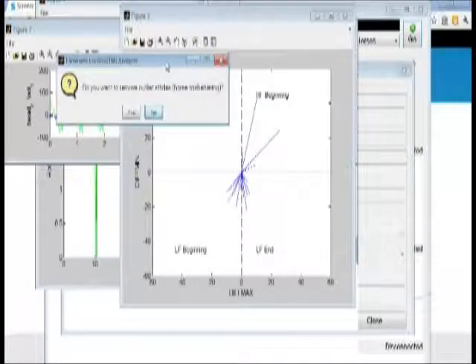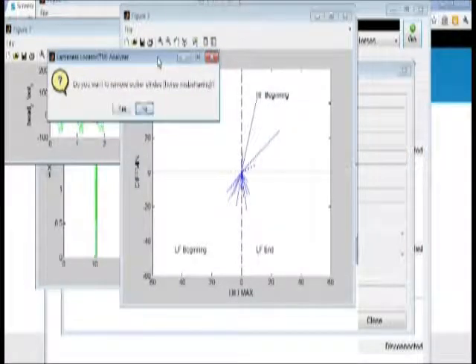In this particular case of a mild left forelimb lameness, since most of the rays are pointing downwards, notice that a few rays are pointing up into the first quadrant. These are most likely outliers and caused by the horse tossing its head during evaluation. Since they are large and unlike most of the other strides, their contribution to calculation of min diff head in this case will be large, reducing the absolute value of the mean and increasing the standard deviation. This interferes with the ability of the user to conclude that the horse has a mild left forelimb lameness.